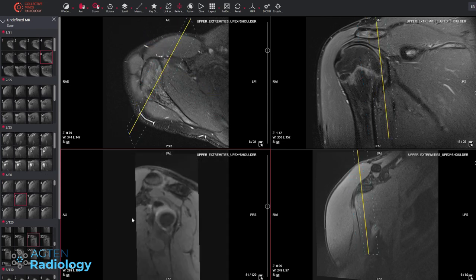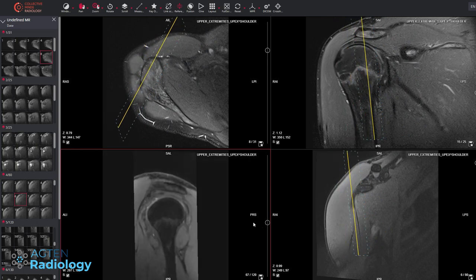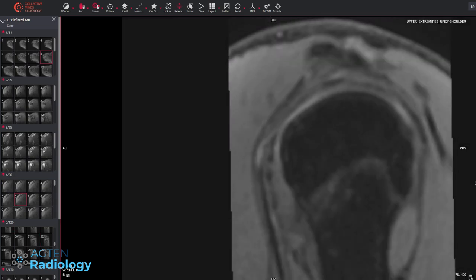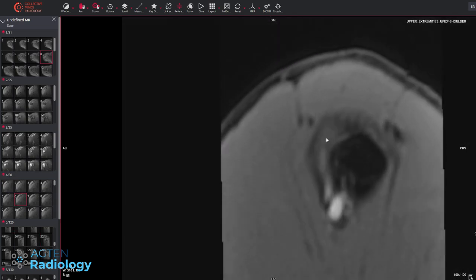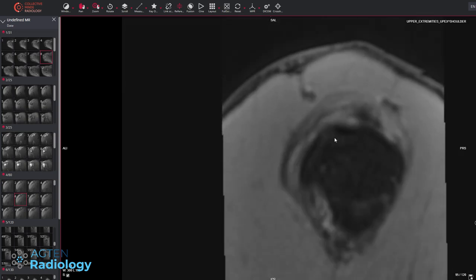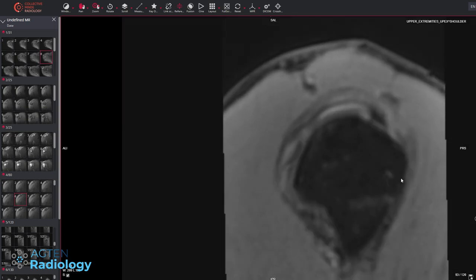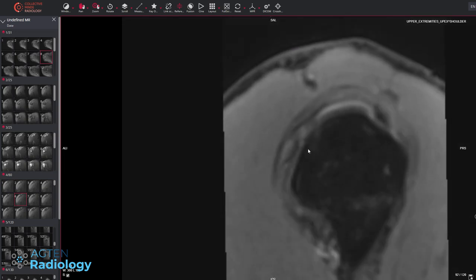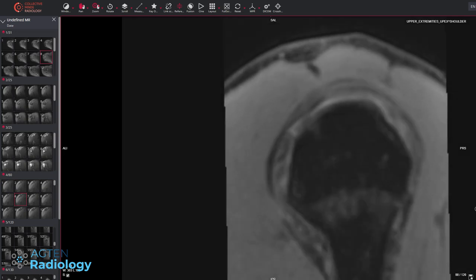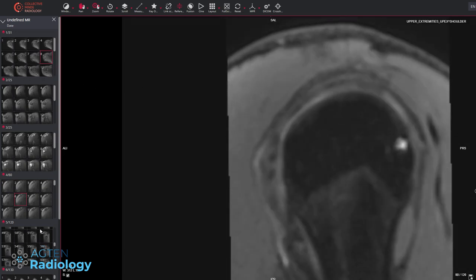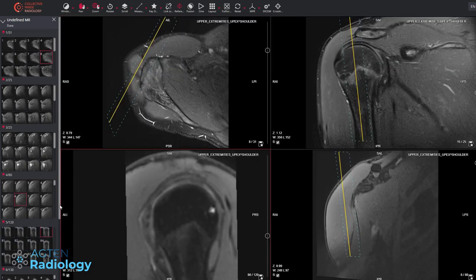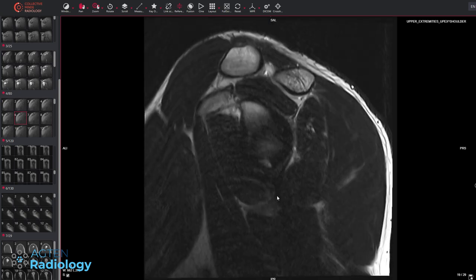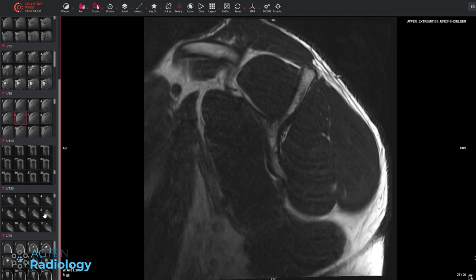There's no proper sagittal here, just a 3D reconstruction — not the best but we can have a look. Even here the cuff looks quite okay all the way down to the superior, middle, and posterior facets — so 1, 2, 3. The subscapularis tendon also looks okay. Then we look at the muscles. On T2 the muscles look very bulky and strong, no obvious edema and certainly no atrophy.